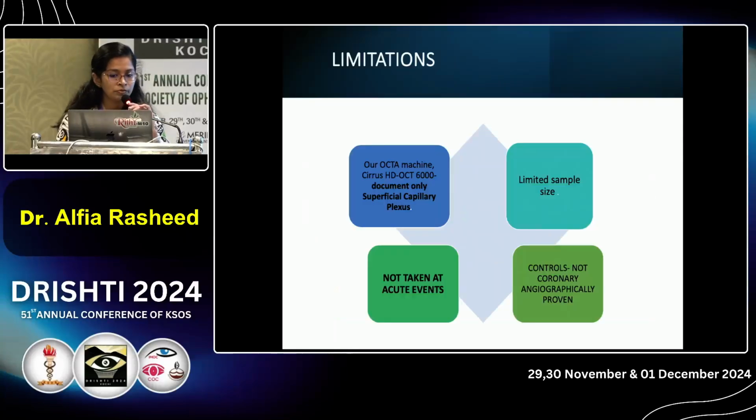The limitations of my study were that only the superficial capillary plexus was studied because our machine was HD OCT 6000, and there was a limited sample size. We had not taken any acute event patients, and controls were pseudo controls because we did not take angiographically proven controls.